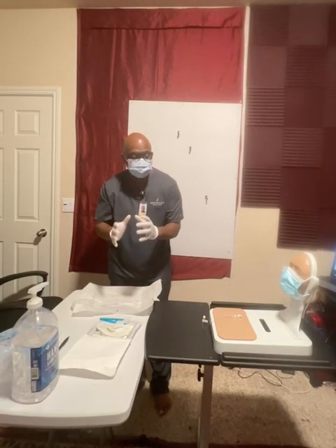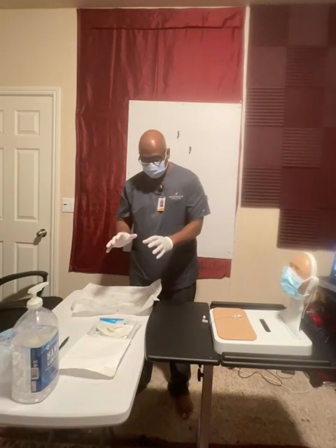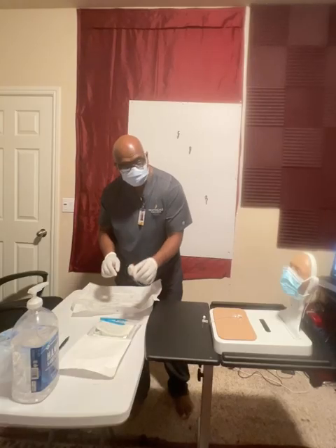Hands are good. I want to make sure I keep my hands in front of me. I don't want to touch anything unusual or anything that's going to contaminate my hands. So what I'm going to be doing now, I'm going to be grabbing the chlorhexidine scrubber.